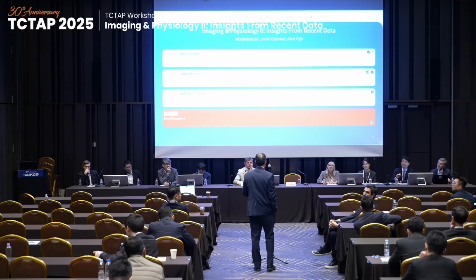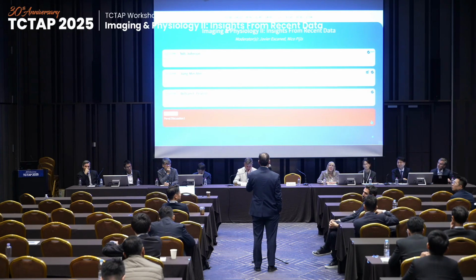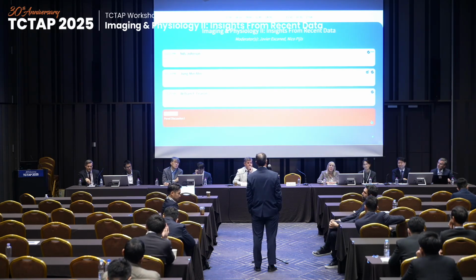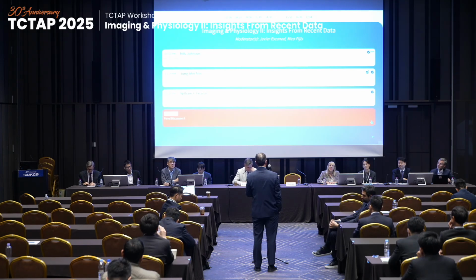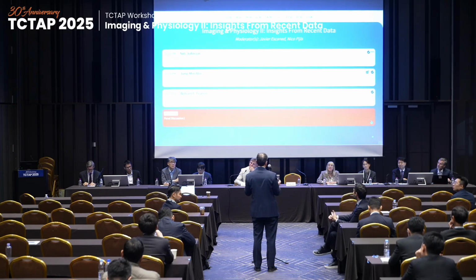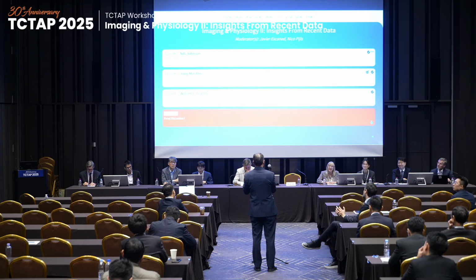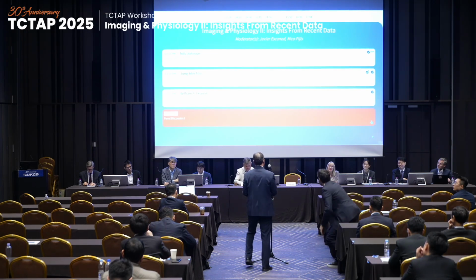Great question, Chang-Wook. I didn't have enough time, but Zsolt Puroth did publish a sub-study looking at post-PCI FFR. About 60% of patients had a post-PCI FFR measurement. We encouraged it in the protocol, but didn't mandate it. And yes, it's not a randomized study, or a sub-study, so it's not really truly a fair comparison. But if you looked at the patients that had post-PCI FFR, they had better outcomes compared to the ones that didn't, for what it's worth.